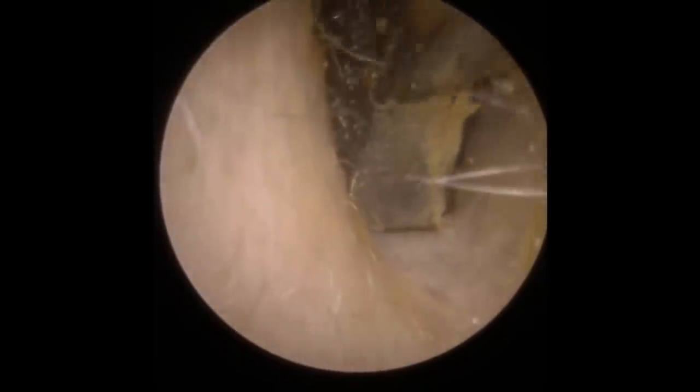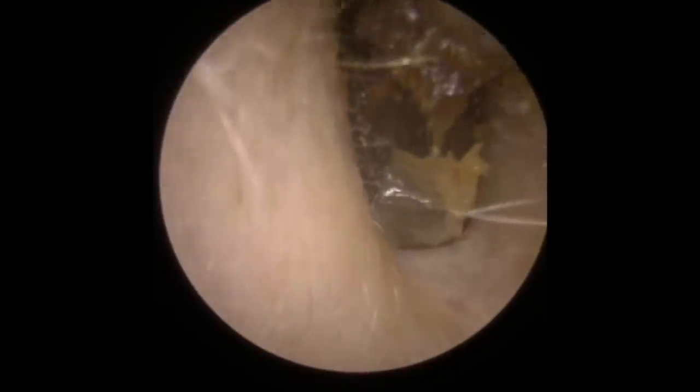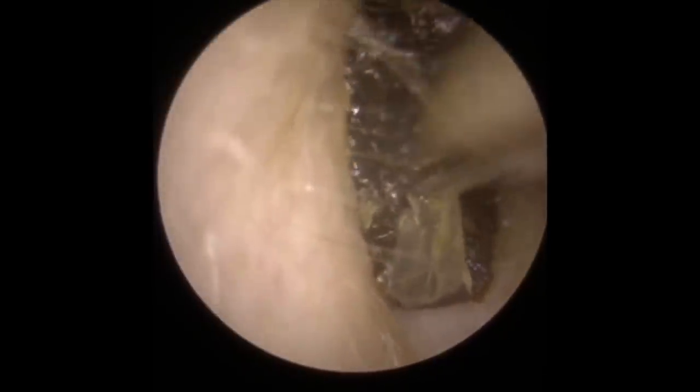Just slowly working this wax up and down. You can see at the moment it's breaking away in smaller chunks. It's quite a large piece. It's difficult to remove it because it's perfectly formed to the size of the entrance to the canal there.